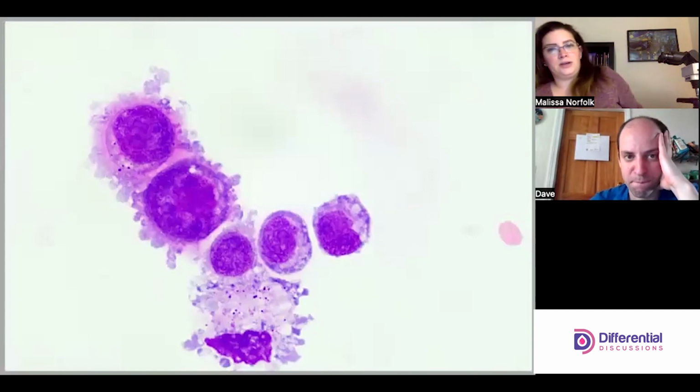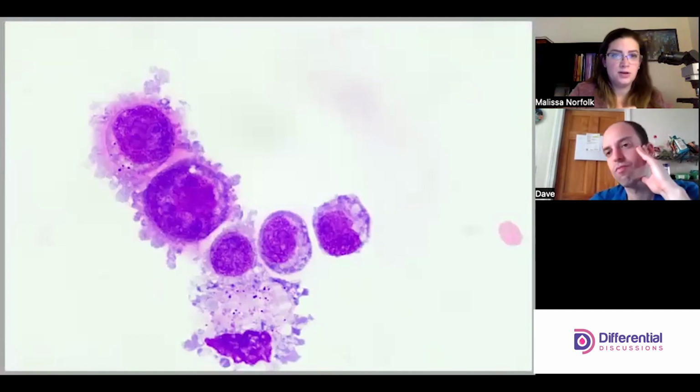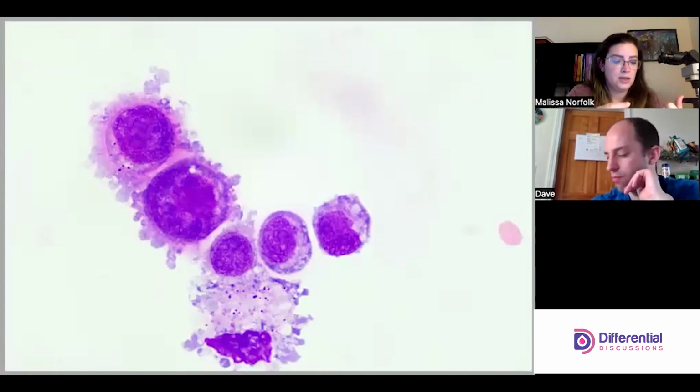Again, in the last video, we described a lot of what the cells are going to look like, what their characteristics are for more malignant cells. Again, lacking the nuclear definition: where does the nucleus end, where does the cytoplasm begin?